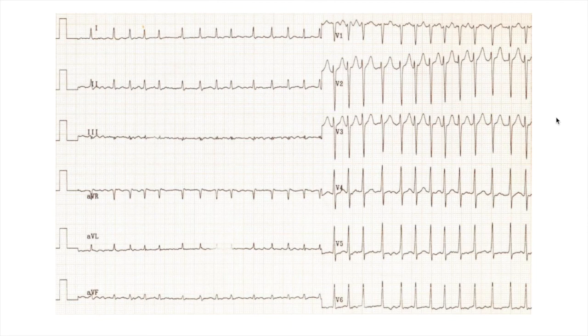Now, just look at this one. You can obviously, straight off the bat, tell there's something not right here. 3 is very small. I would call that isoelectric maybe. Also look, you can instantly tell this is not in sinus rhythm. They're all over the place. I can't detect a pattern. I would call it irregularly irregular. So now that you already know it's irregularly irregular, you can probably think, oh, maybe AF.